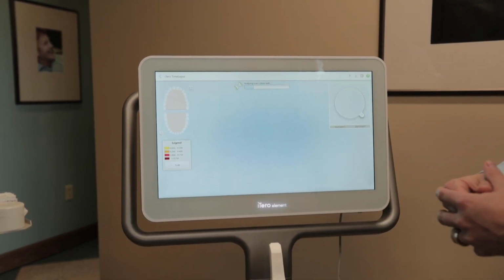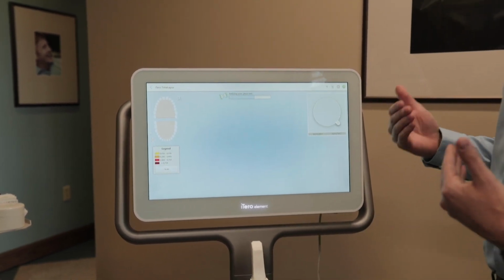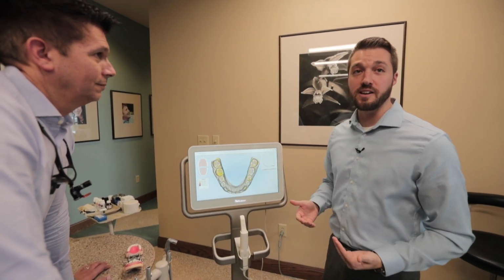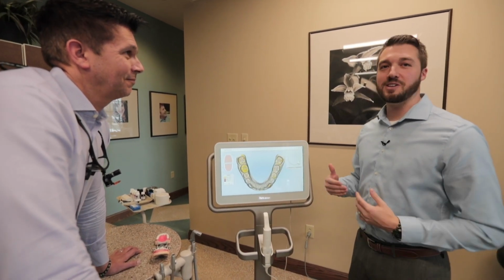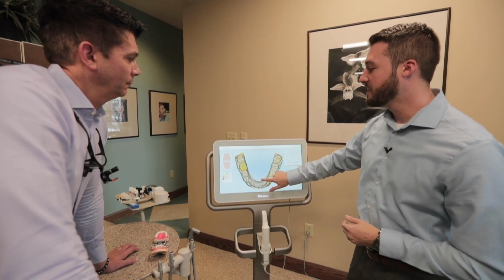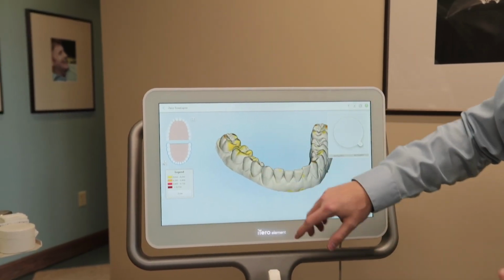Again, what we always want to make sure we use as we're talking to the patient, and this is what we really coach a lot of our doctors, is using terms that end in -ing. It's not that your gum didn't recede, it's receding. It's the act of something happening. So here we have our teeth wearing. Now we can show the patient on this 3D model.